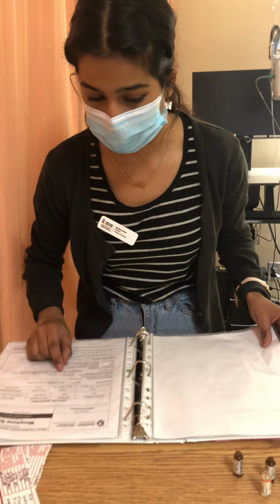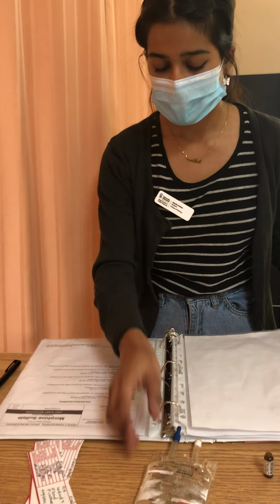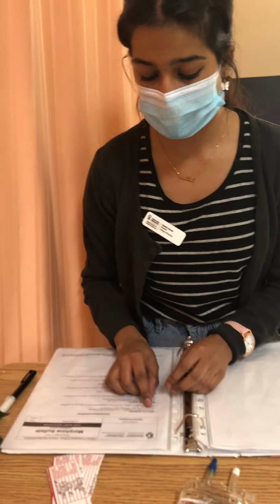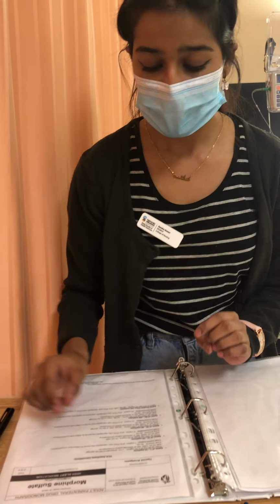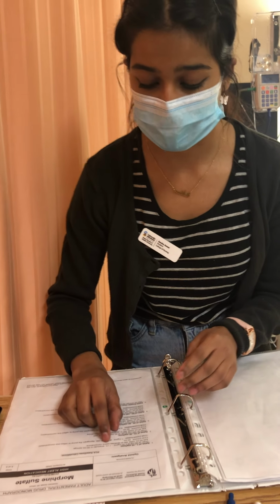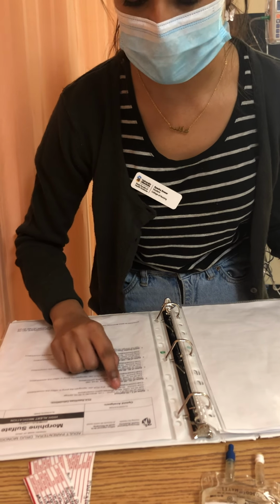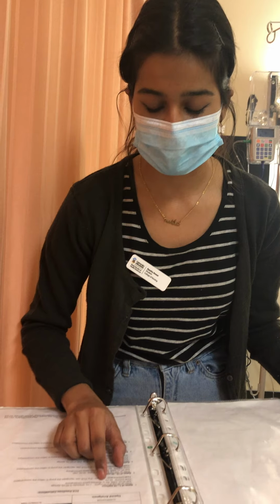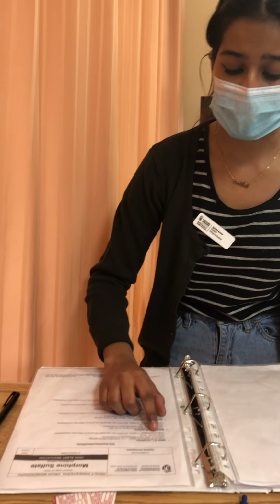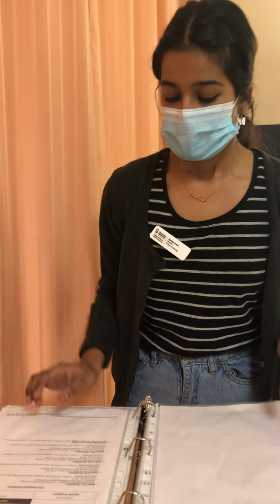The compatibility is normal saline, which is what we're going to be using. So I have a mini bag of normal saline over here. The recipe for the PCA is that we have to draw up 50 milligrams of the medication, which will come down to 5 mils because we have 1 mil ampules. We have 5 of these 1 mil ampules, all of them concentrated at 10 milligrams per ml. And we're going to be using 45 mils of the normal saline, which I have in the bag, to get a final volume of 50 mils and a final concentration of 1 milligram per ml. So I've reviewed the PDM.